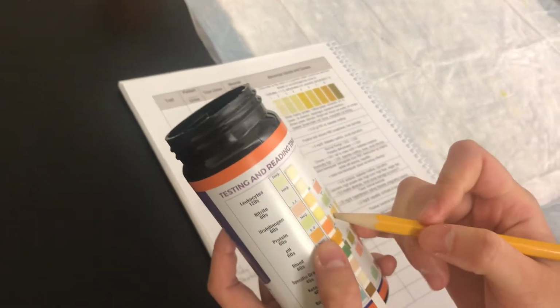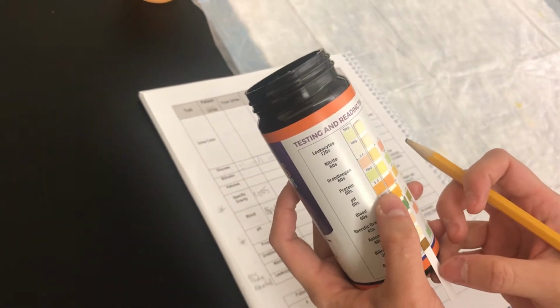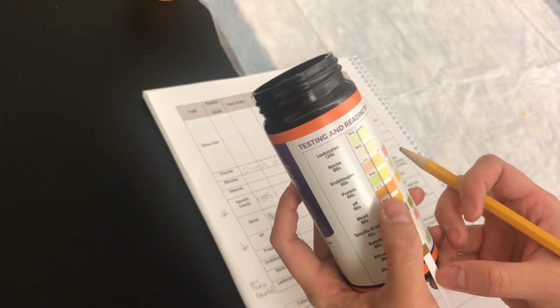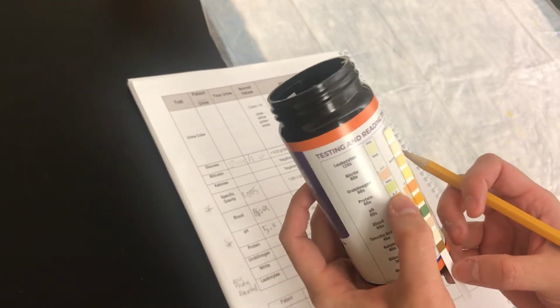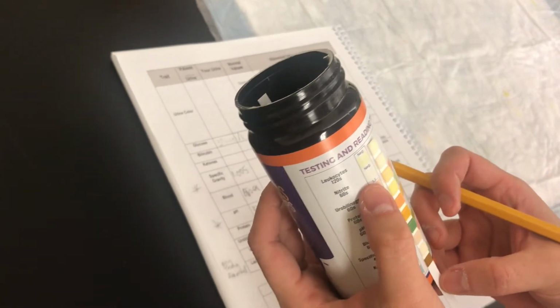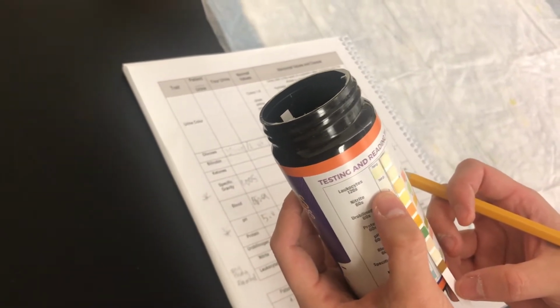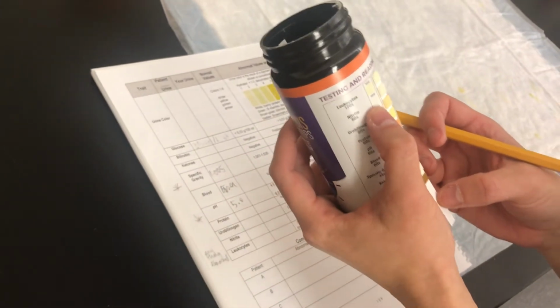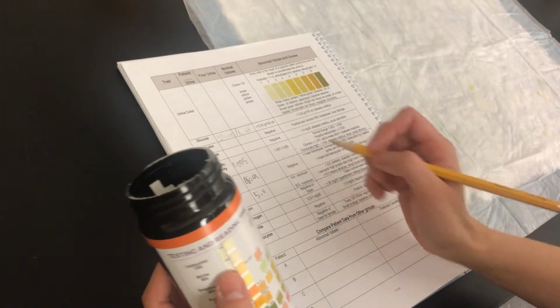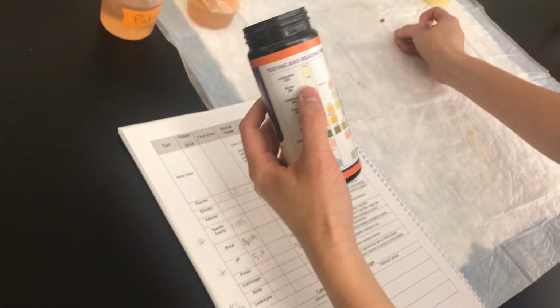And then we don't see any presence of proteins, which is great, right? If you saw the presence of proteins, that would mean that you have some impairments in kidney function that allow proteins to get through the filtration system. And your urobilinogen looks fine, no nitrites and no leukocytes. And the fact that both leukocytes and nitrites are negative suggests that there are no infections in this patient, okay? All right, so that's urine testing for patient B.